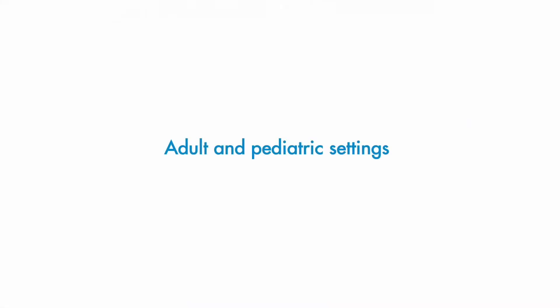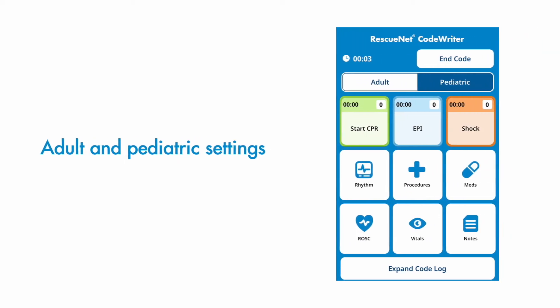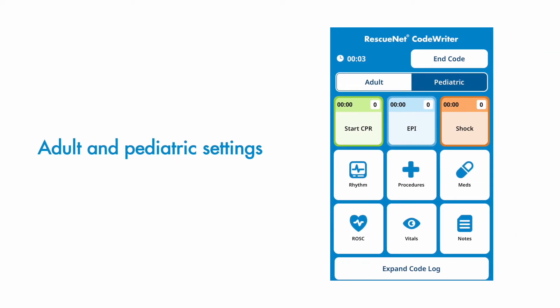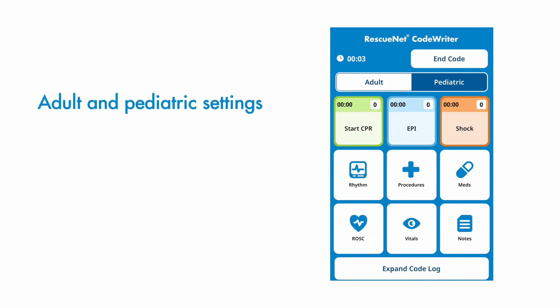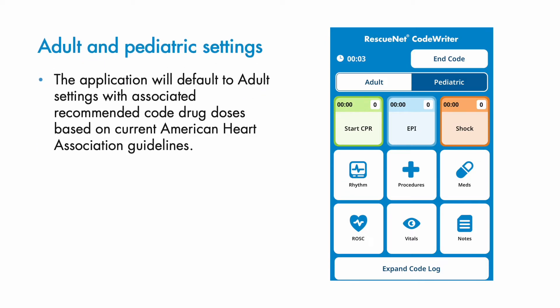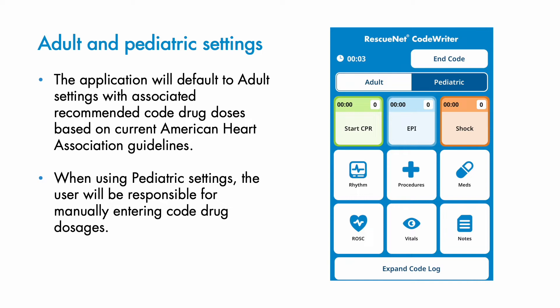Tapping Start New Code launches a documentation screen set to adult mode by default. Users can easily toggle between adult and pediatric modes using the buttons at the top of the screen. In adult mode, CodeWriter suggests common drug dosages based on current American Heart Association guidelines. In pediatric mode, the recorder must enter drug dosages manually.